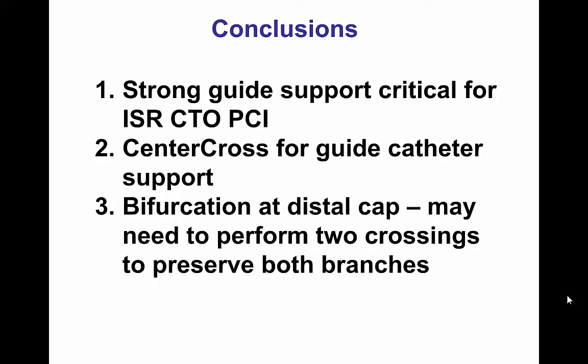The other important message from this case is that having a bifurcation on the distal cap may make canalization of both branches challenging, because canalizing one branch may lead to occlusion of the other. In this particular case, the wire went into the posterolateral branch and we had to perform retrograde crossing to restore flow in both the PDA and the posterolateral branch. A final result was achieved with flow in both branches.